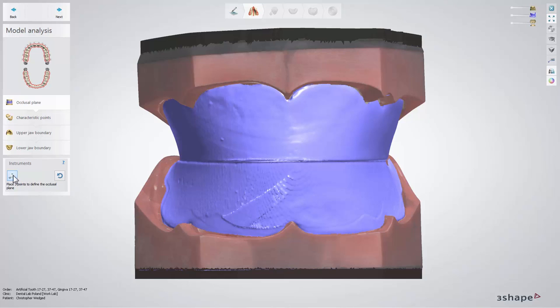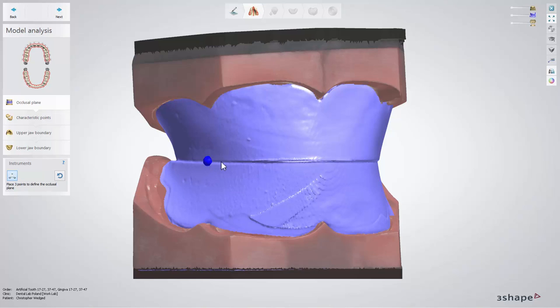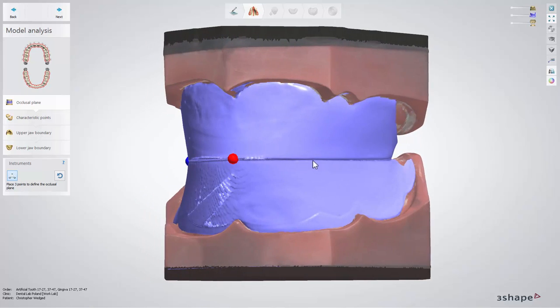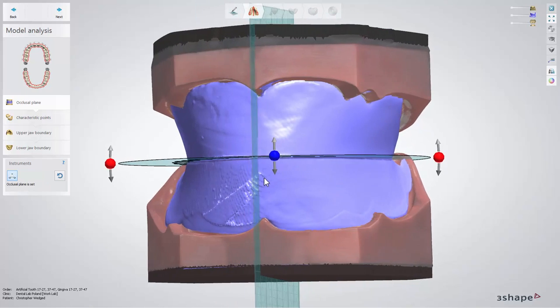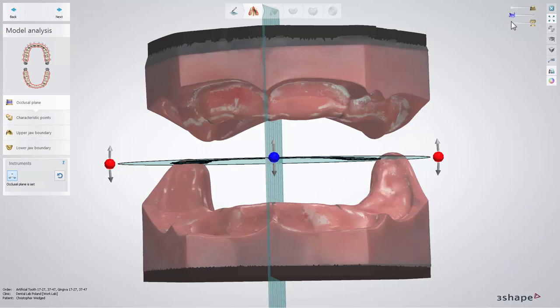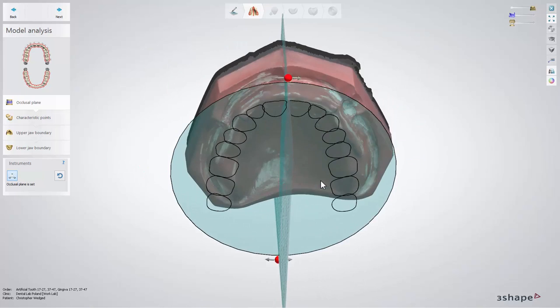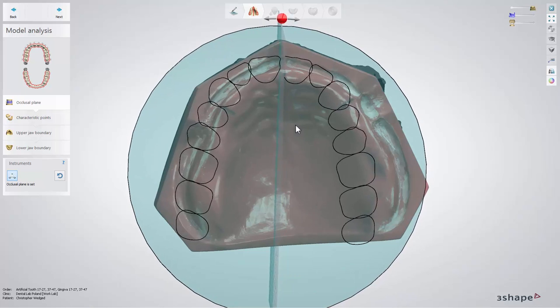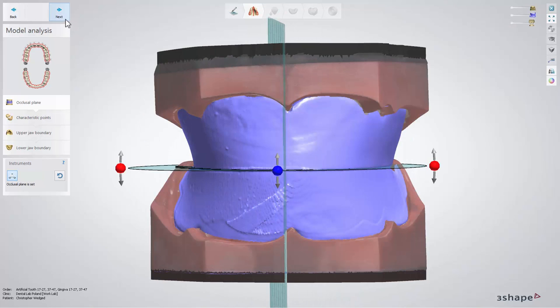At first, we need to define the occlusal plane with the help of three control points. You can see here that our wax rim comes in very handy defining it easily by following the line which the dentist has arranged. Keep in mind that placing the second point defines the direction for the front teeth. If the middle line wasn't defined by the dentist, you can verify this yourself. Make the lower model less visible and place the occlusal plane in relation to the palatal suture. Click Next when finished.